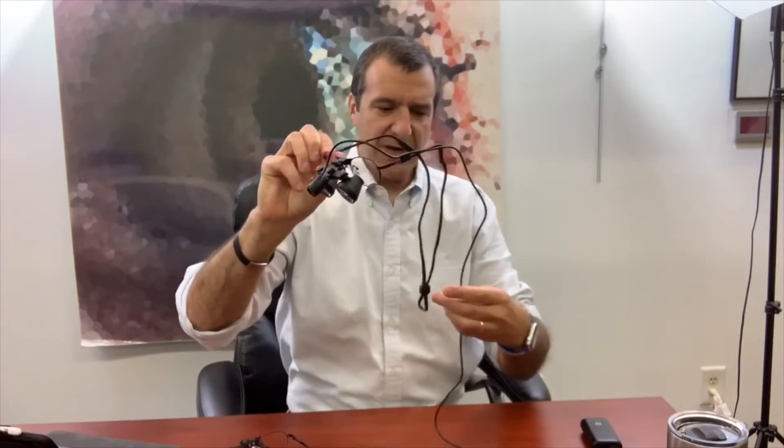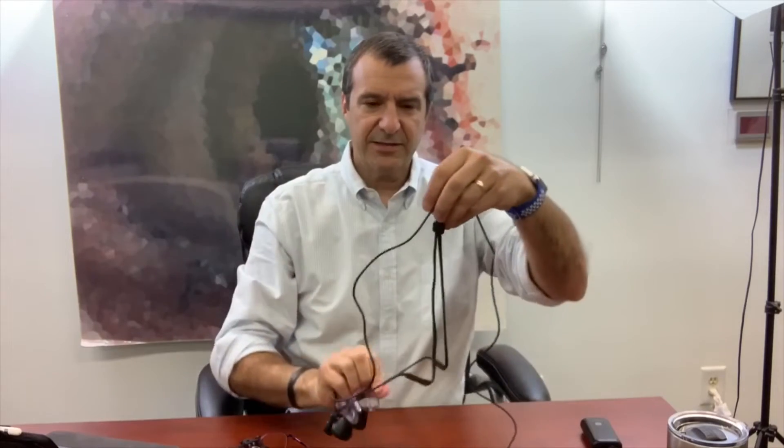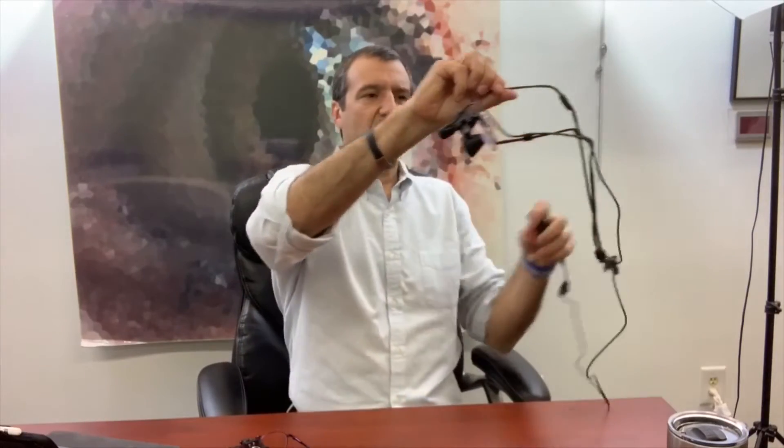There are two things that can be done with the wire. One is you can clip it to your shirt — put it on, clip it to your shirt, and run the wire behind you. Another easy way is to clip the wire to the lanyard that comes with the Craft Optics, put the whole wire behind your back, and hang it around your neck.